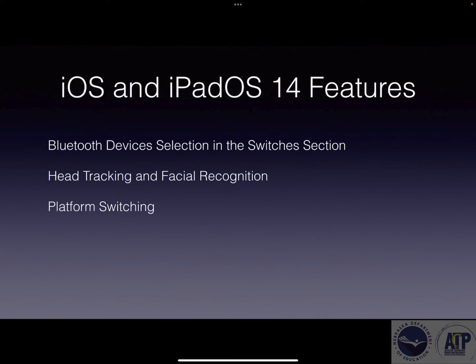Platform switching, the ability to switch scan on your iPad, but then control, let's say, a MacBook, or if you want to control your Apple TV or another iPhone, you can actually do that from your switch scanning on your iPad. You just give control over to another device. You scan on that device, and when you're done, you can give control back to control your iPad.